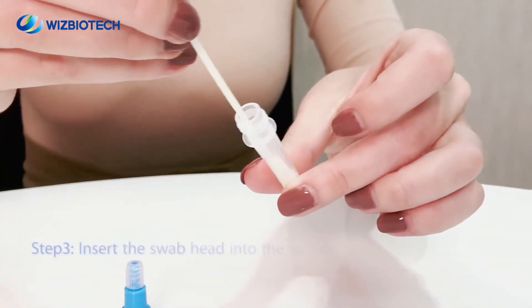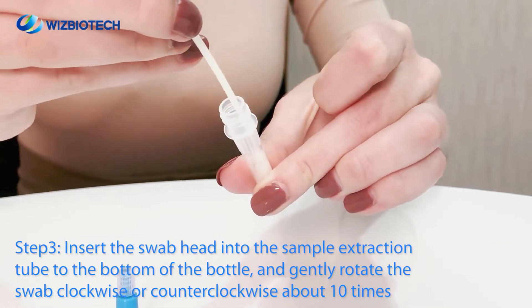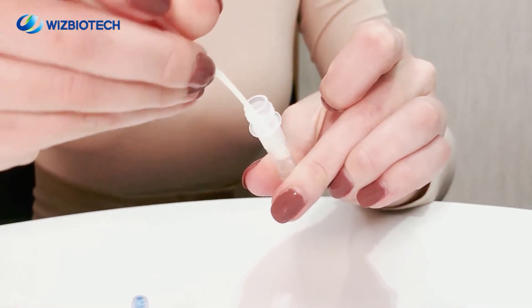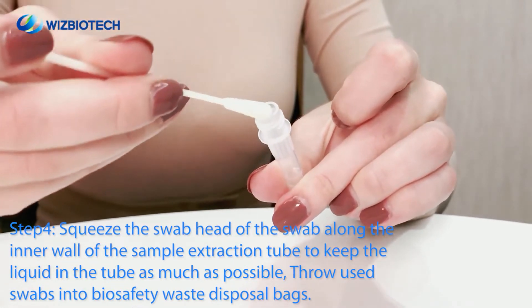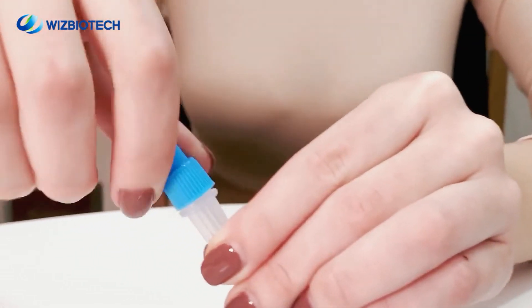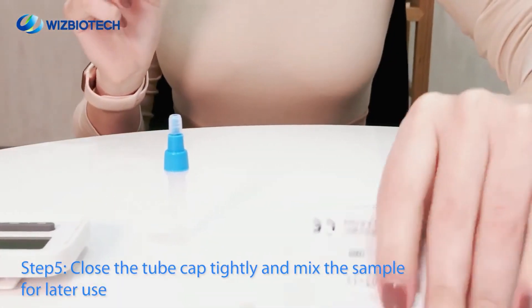Step 3. After completing the sample collection, insert the swab head into the sample extraction tube to the bottom of the bottle and gently rotate the swab clockwise or counter-clockwise about 10 times to dissolve the sample in the extraction solution as much as possible. Close the tube cap tightly and mix the sample for later use.